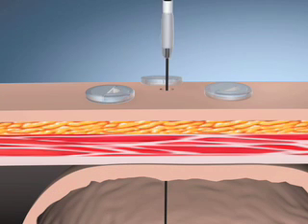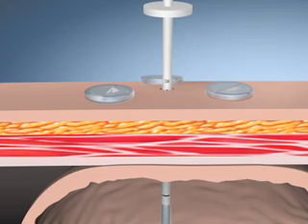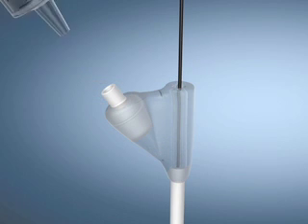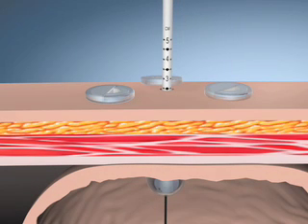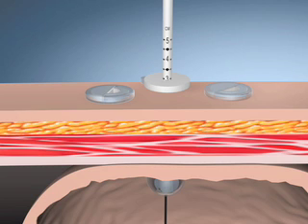Advance the stoma measuring device over the guide wire, through the stoma tract and into the stomach. Fill the Luer slip syringe with 5 milliliters of sterile or distilled water and attach to the balloon port. Inflate the balloon. Pull the device toward the abdomen until the balloon rests against the inside of the stomach wall. Slide the plastic disc down to the abdomen and record the measurement proximal to the disc.